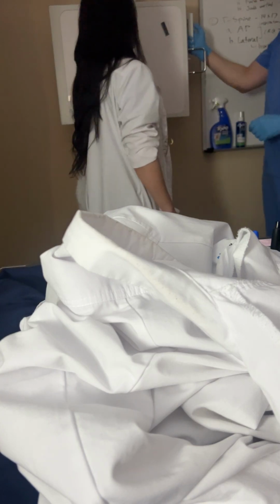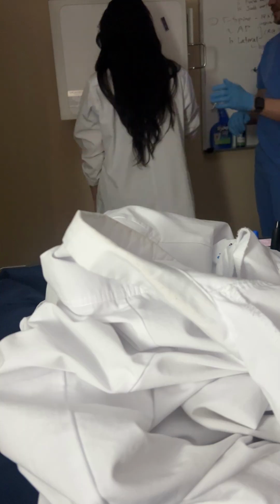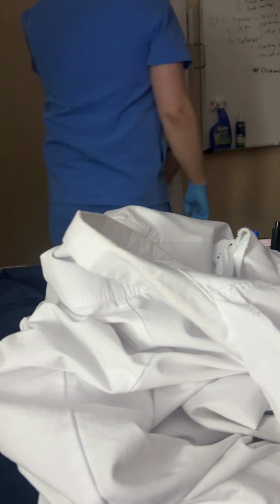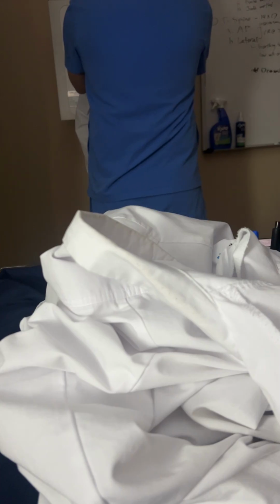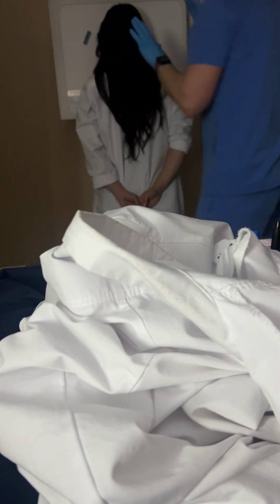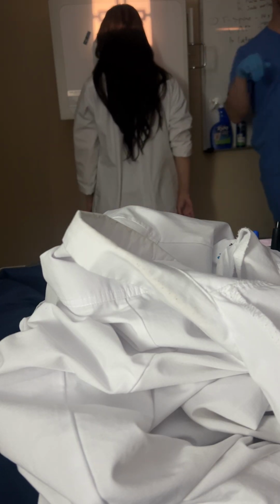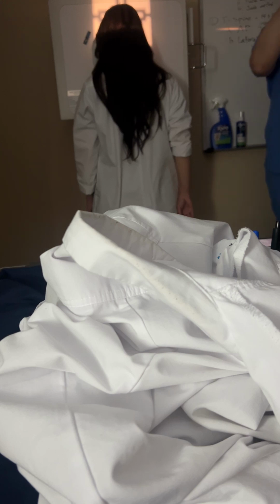We're going to put her forehead and her nose up against this board. You don't have to touch it unless you don't want to. We're going to make sure she's nice and centered and that there's no rotation and no tilt except for the tilt that we want. We have her forehead and her nose touching the board. Why? Because that gets the OML perpendicular to the board.